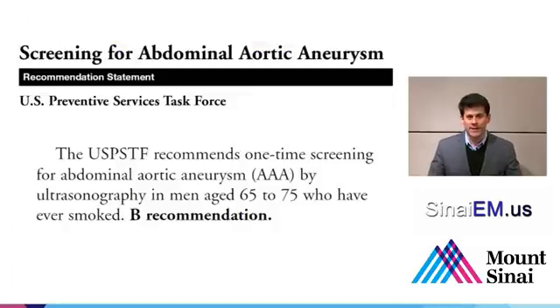So with that in mind, we've already spoken about the abdominal aorta, its anatomy, how to find it, how to measure it, and the importance of measuring the distal part of the abdominal aorta as well as into the iliacs. So there's one issue that comes up every now and then in primary care environments. It's very important in the radiology world, and it's come up a few times in the emergency medicine and acute care environments as well. Should we be screening for abdominal aneurysm?